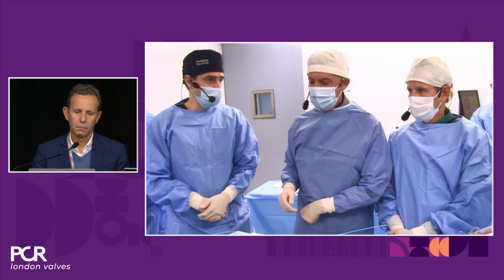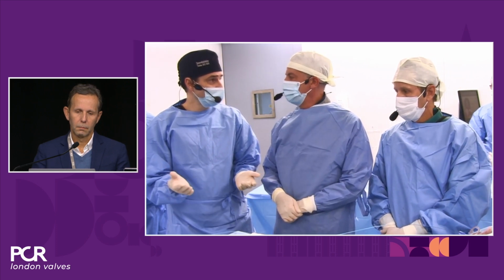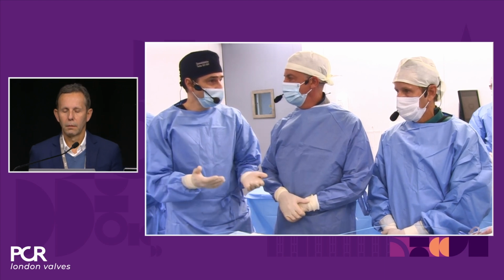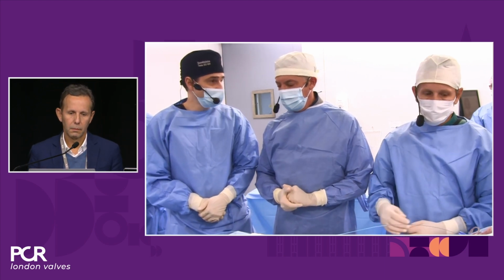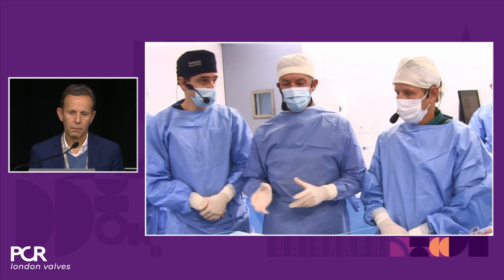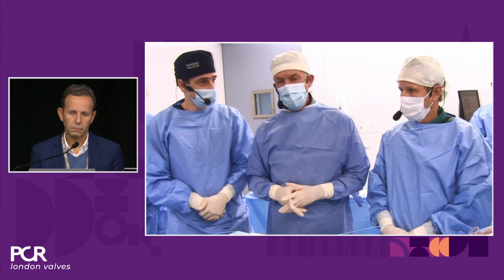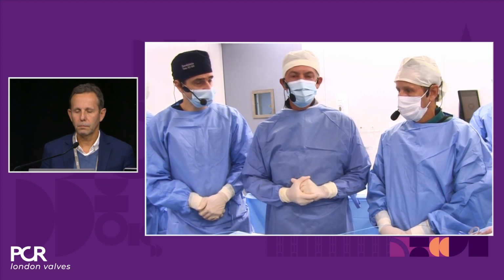And maybe, Alex, given the fact that it captures 5 times more debris than the current generation, it may be meaningful in terms of clinical stroke. This potential advantage, which Henrique just mentioned, was proved in a previous study. That was the rationale for the study design, as I mentioned, 500 patients randomized against Sentinel.